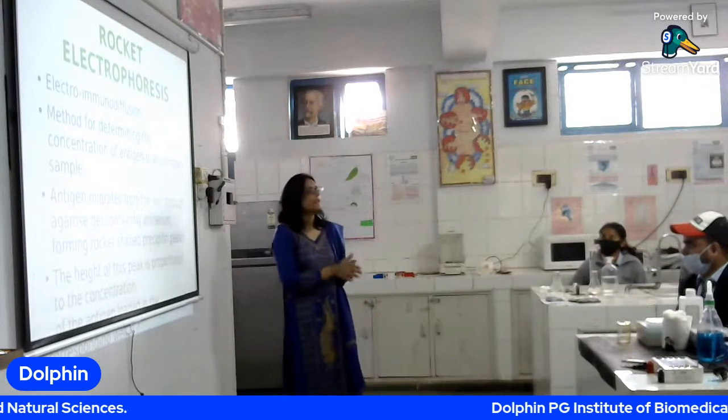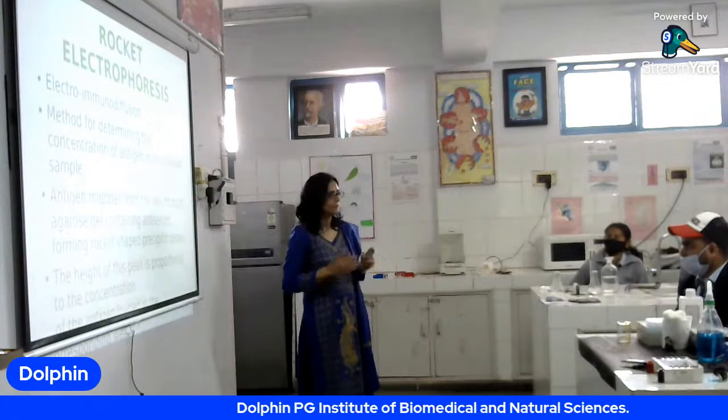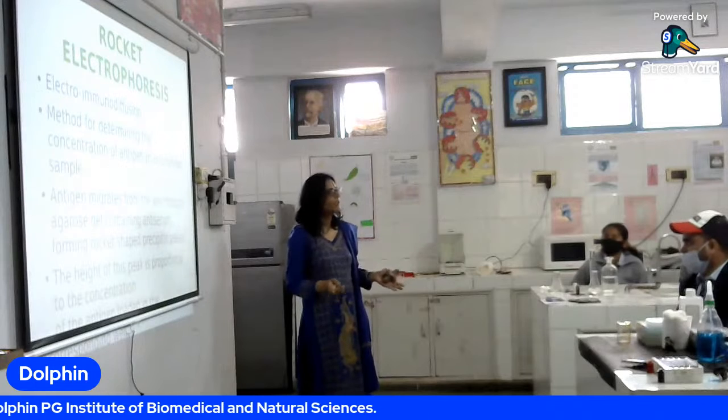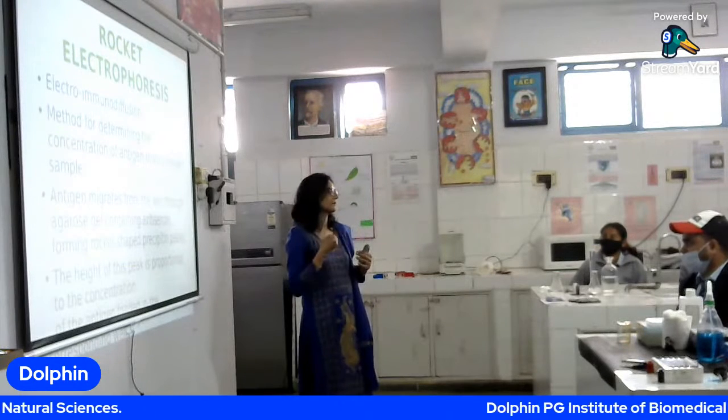Now here antigen कैसे जा रहा है? सीधा जा रहा है. Why? सब कहीं भी जा सकता है ना, जब वेल में डाला है तो कहीं भी जा सकता है. But why? क्योंकि उसको खींच के लेके जाया जा रहा है. Something is dragging it. Okay?